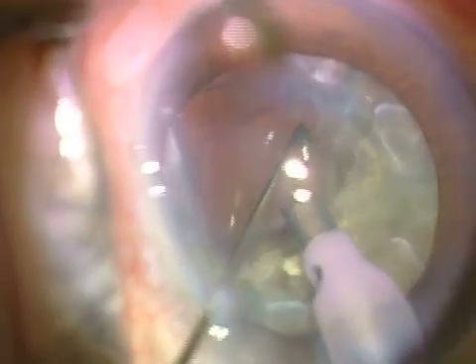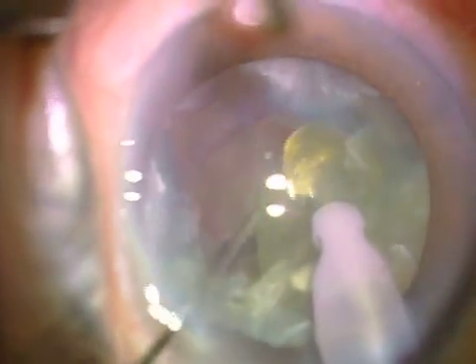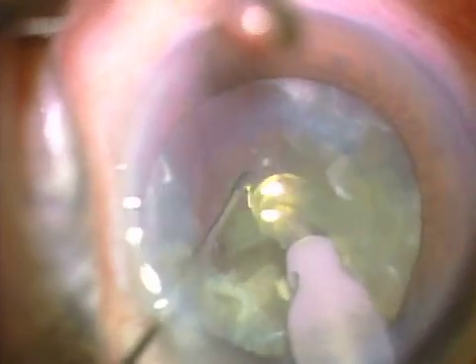I like small sections because less material escapes the tip. With Helon 5, a very cohesive viscoelastic, with low vacuum settings of about 110 millimeters of mercury, the viscoelastic is staying in the eye so that this is a very small compartment. The second half is similarly fractured and removed.